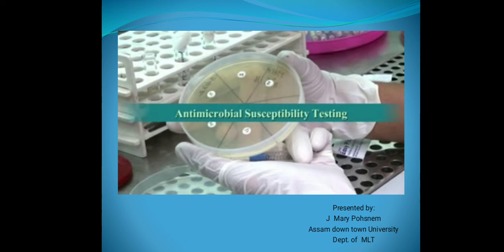This requires 60 ml in case we are using a 150 mm plate and 25 ml in a 100 mm plate. So the amount varies with different sizes of plates. For certain fastidious microorganisms, 5% defibrinated sheep blood is added to the medium. So it depends on the microorganism, right?